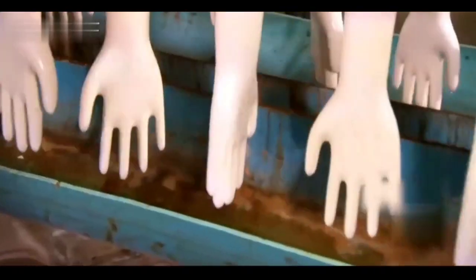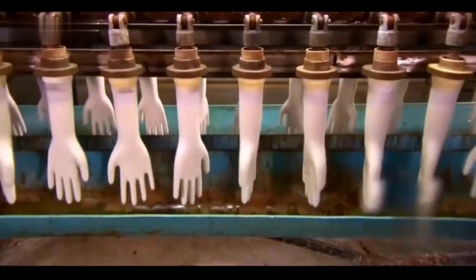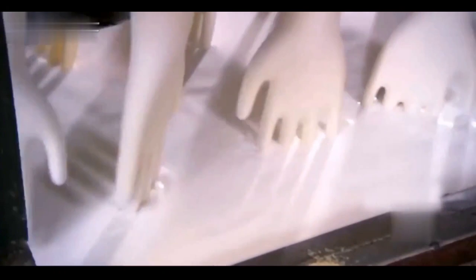At this point, the cleaned glove molds are sent on a conveyor belt to air dry, shaking off any residual moisture on the molds by rotating them, followed by solidification for the molds.